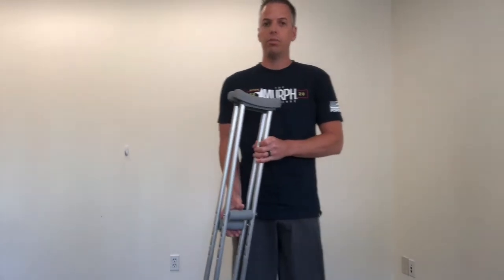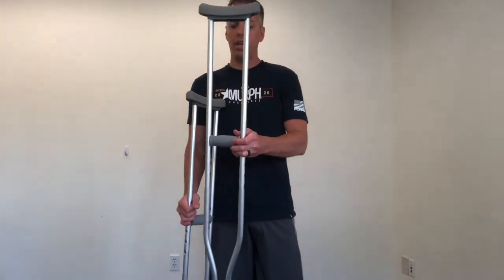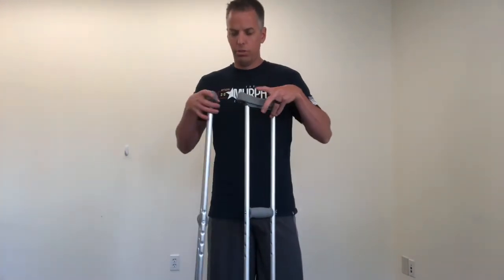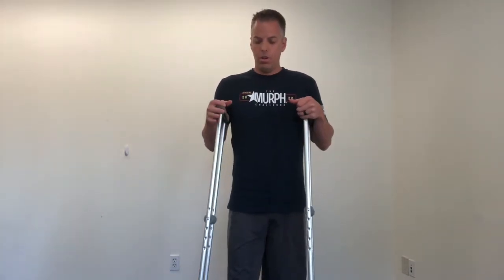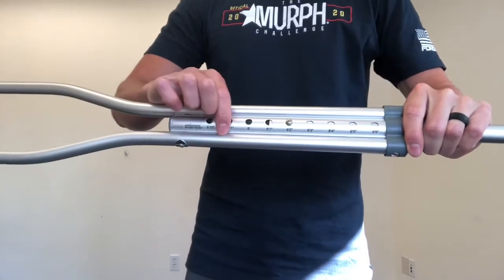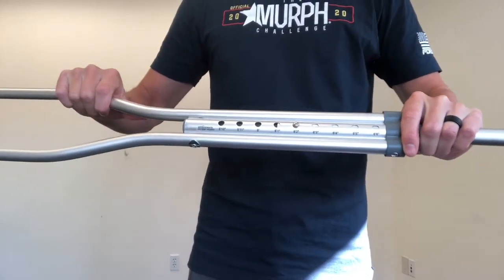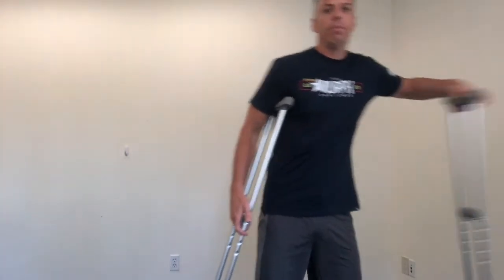There are a couple of different ways you can adjust the crutches. You can adjust the overall height and you can also adjust where the hand grip position is. What usually happens is in the doctor's office or the recovery room, the nurse will ask you how tall you are, then look at the heights on the crutches and adjust to that. I'm 6'2", so I put it on 6'2", and if I stand up, these crutches are too high for me — there's no space between my armpit and the top of the crutch.